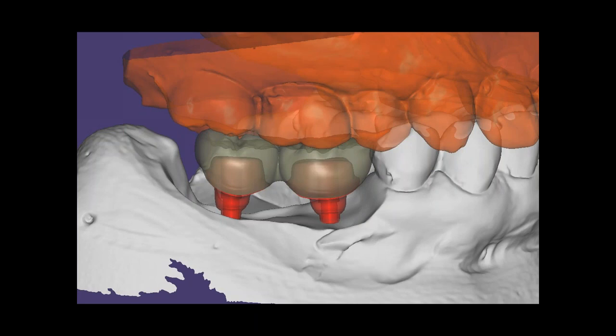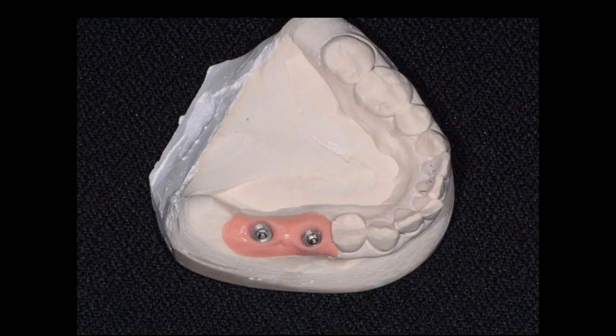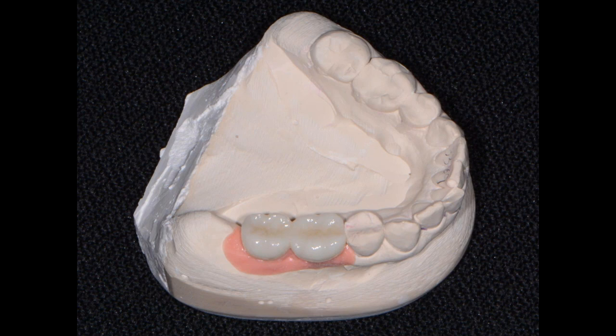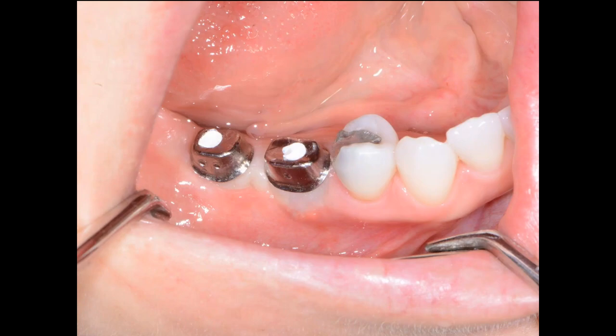So here we see a digital preview from the laboratory of the custom abutments and full zirconia crowns. This is the lab work for tooth number 30 and 31 positions. Notice the CAD-CAM abutments and then the splinted crown restorations. So here you see in this slide, we've positioned both abutments and torqued them to 25 to 30 Newton centimeters. We've blocked out the access openings with the Teflon tape.